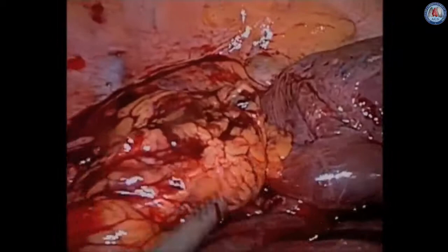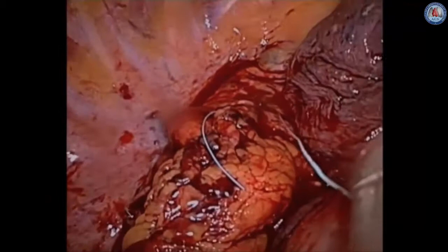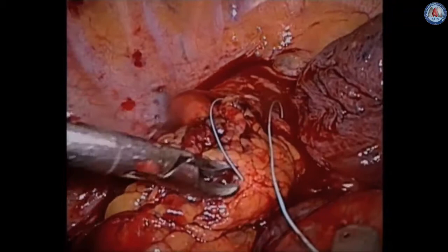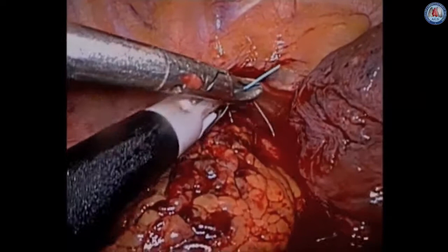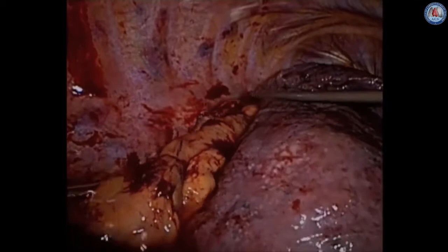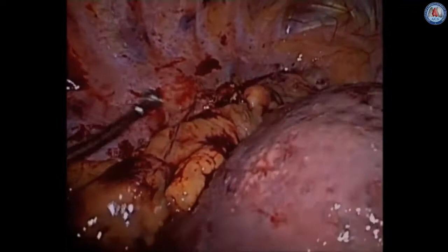We then cover the entirety of the staple line with our omentum to form our omental patch, suturing it onto the edges of the pleura above and through the mediastinum more inferiorly. The chest is then copiously irrigated. You can see that the entirety of the conduit is covered with omentum to protect it. We place a couple of chest tubes in the chest cavity for drainage, and the case is complete.